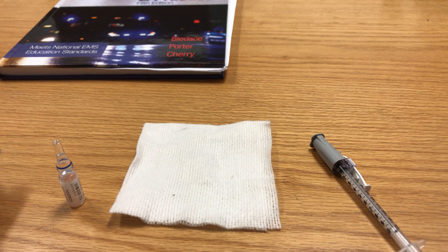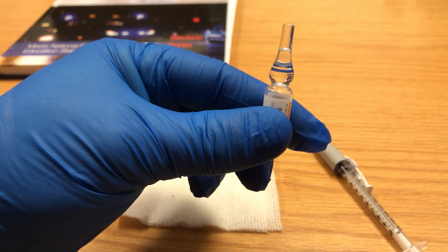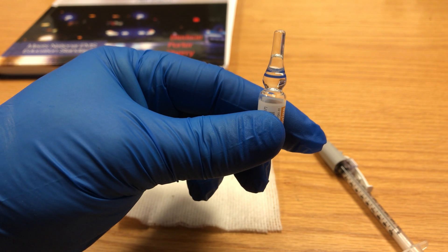Getting medication from an ampoule. We have ampoules, typically this is epinephrine, although there's a few other medications that we can administer.